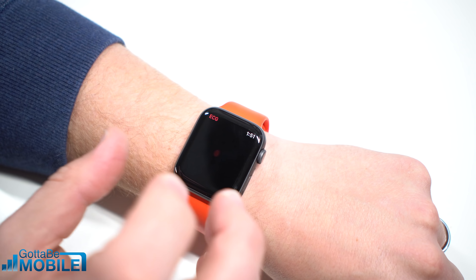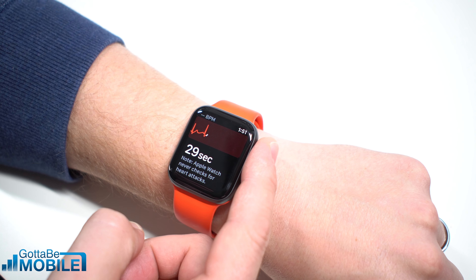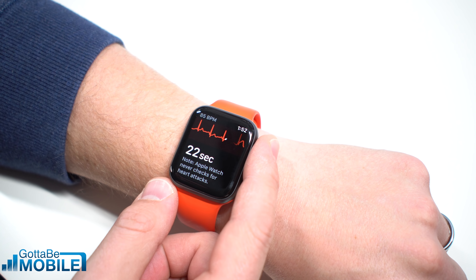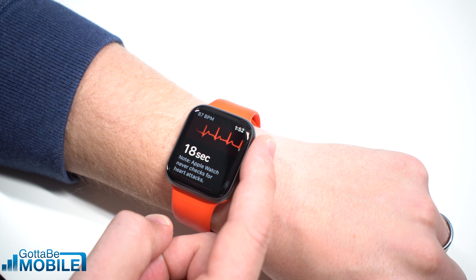So you're going to tap on that. You're going to be able to put your finger right here and hold it for 30 seconds. You're going to want to have your arm resting on a table or something like that, and you're going to keep your finger on that digital crown for the whole 30 seconds.